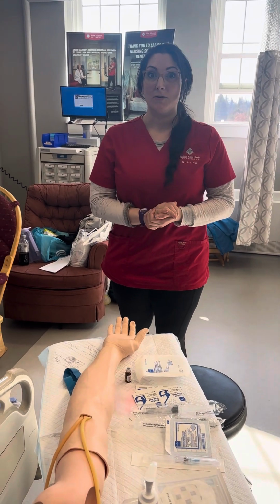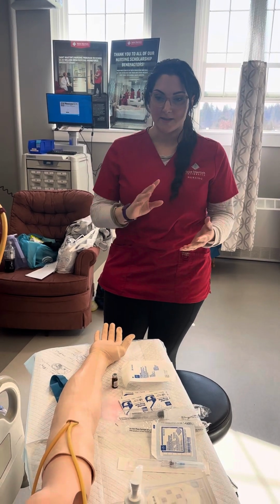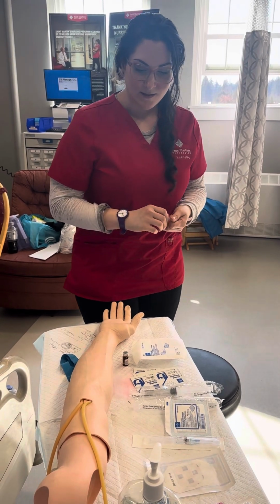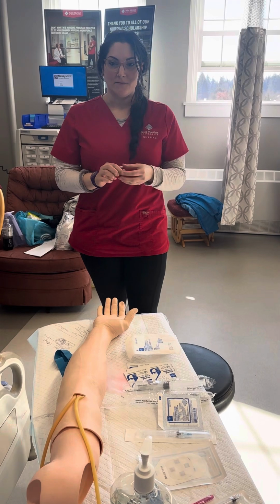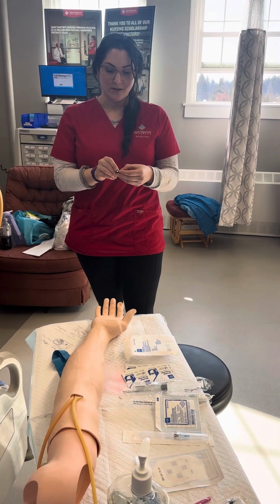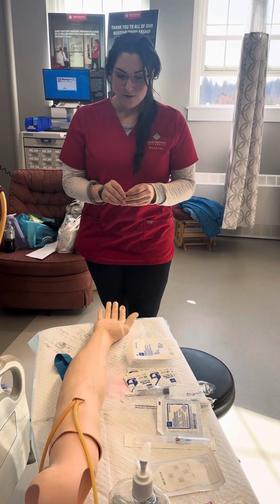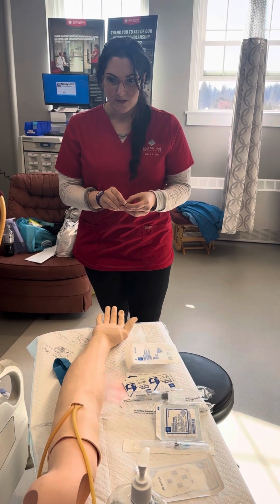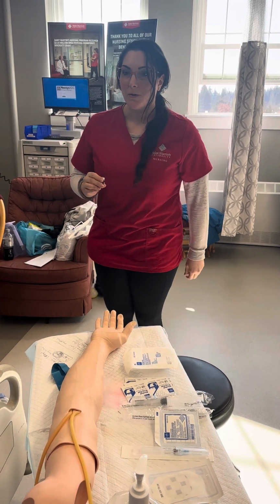He has no known allergies, and he has no allergies to tape or any of the products that I'm going to be using today. I have the right medication, which is morphine, the right patient, which is Scott. I have the right dose, which I have a 10 milligrams per milliliter vial here, and the doctor has ordered 3 milligrams, so I'm going to be administering 0.3 milliliters, and he will be receiving 0.1 milliliters per minute.